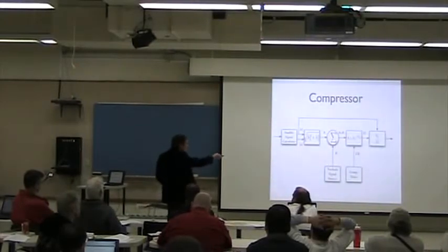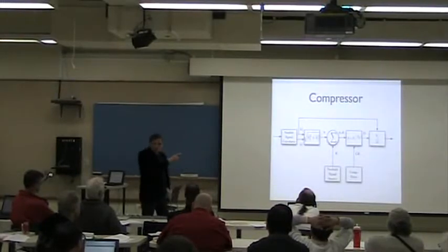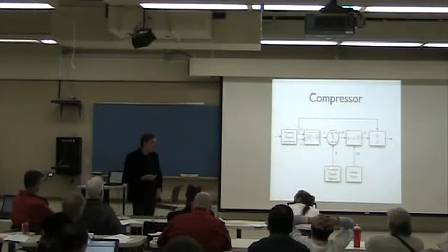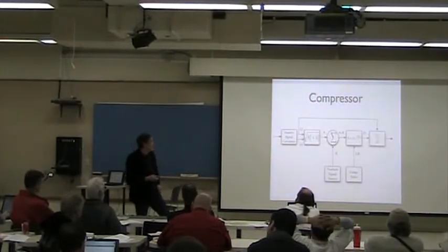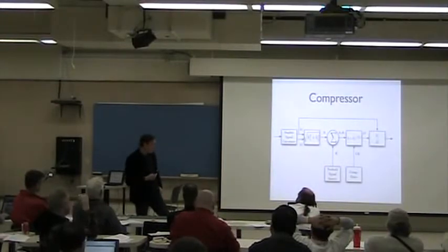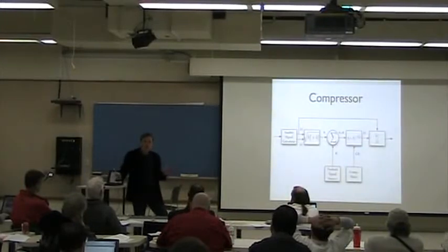And then we have this part. And it's very important that we use division. Because initially we said, okay, who is interested in the division? Because if you can reverse the number you're going to divide by, then you can use multiplication. And when you're talking about fixed point, it's not equivalent, because you lose your accuracy on the edges of your dynamic range.